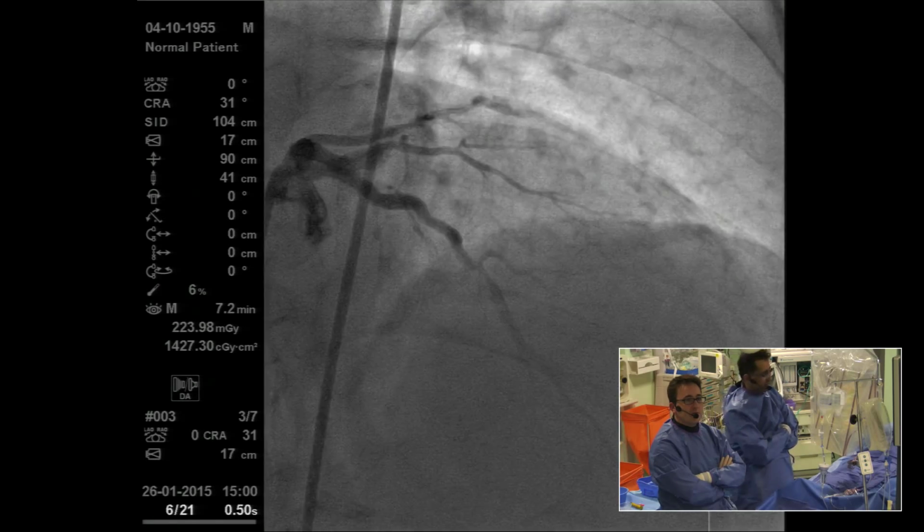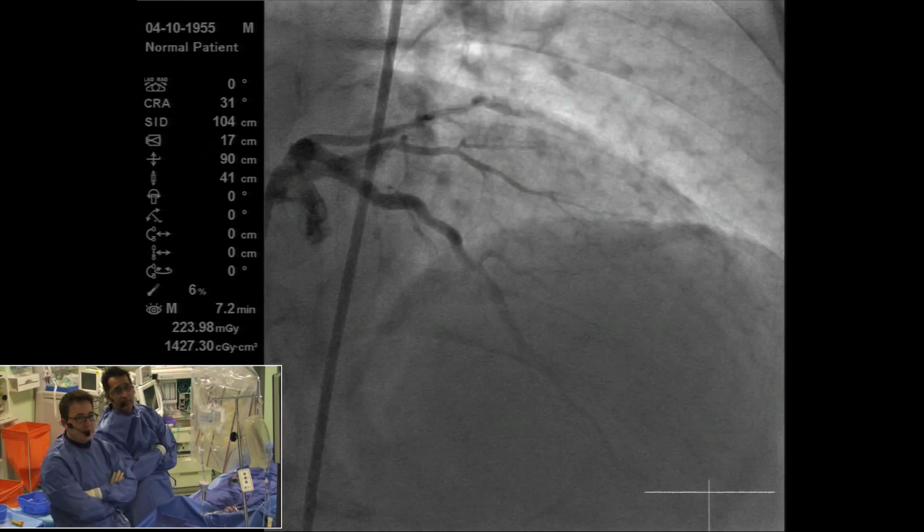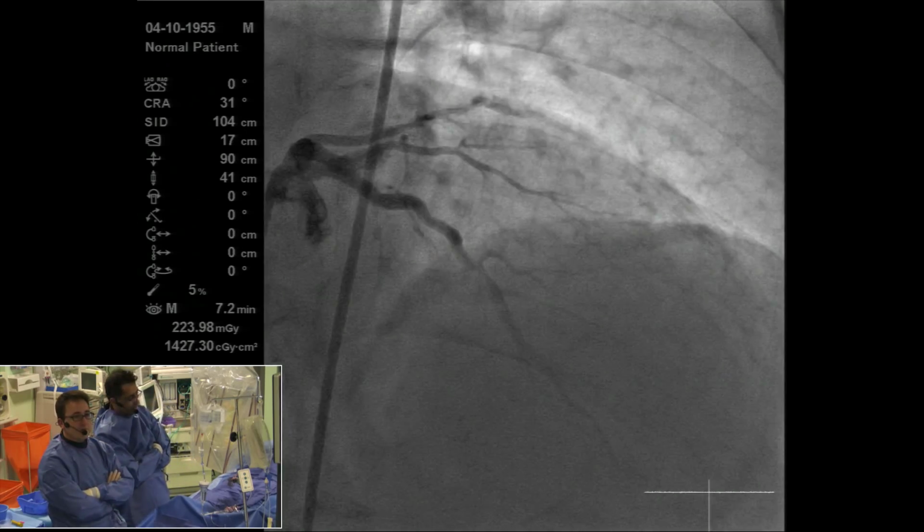But actually, this is where the physiology comes in. Your eye might be drawn to put a stent exactly where that second diagonal is and say, what a great job we've done. Well, I've got to say that this is a borderline iFR at the best of times, and what it shows on the pullback is diffuse disease. There hasn't been a jump spectacularly at that spot. It's been all the way through, and if we treat that one spot, yes, we may marginally improve the iFR, but we're giving a patient a stent, and I suspect this is not where the angina is coming from.